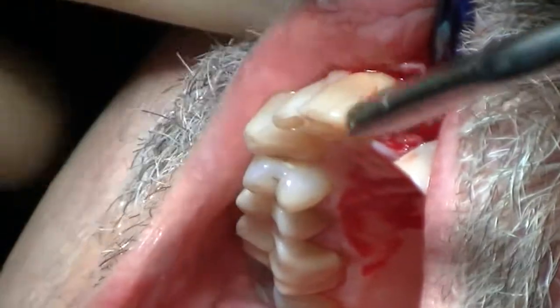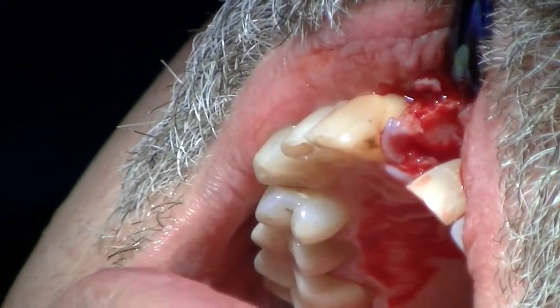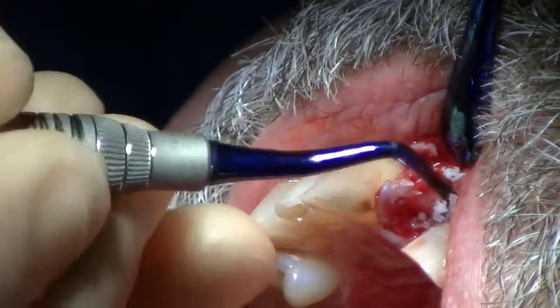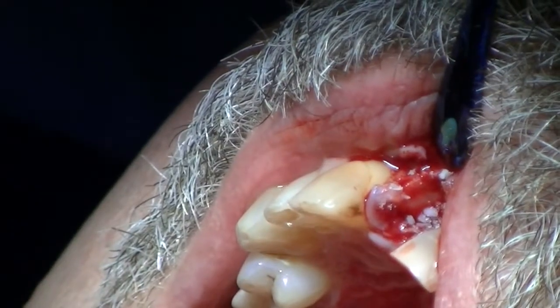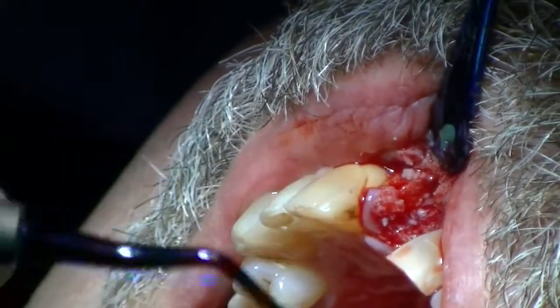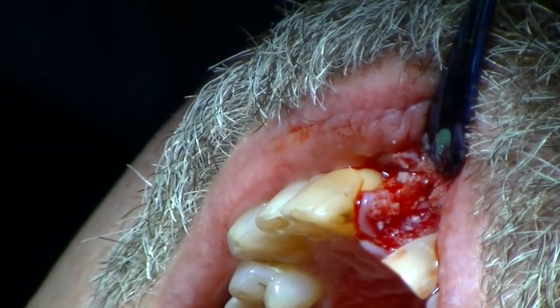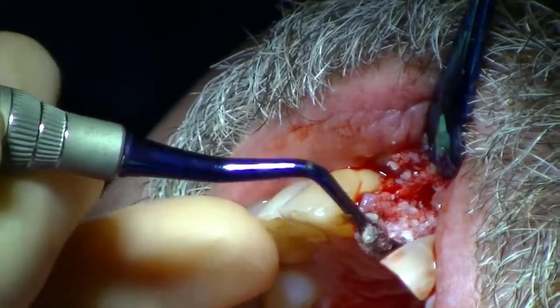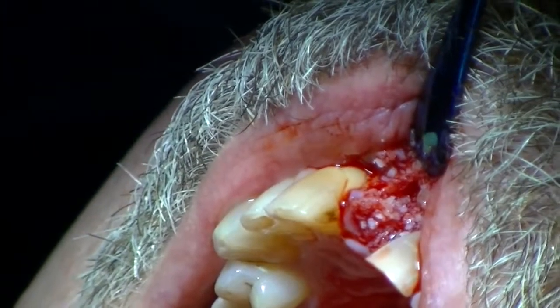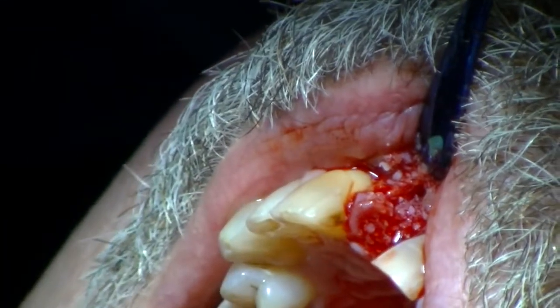So we have our defect here, and we're not going to suction now. I'm simply going to take my allograft material that I wetted, and I'm going to place it into the socket. If it touches the tongue, do not grab it off the tongue. It's just simply like caulking. Just enough. Can you suction that little piece off the tongue? I'm not packing it firmly, it's just loosely packed there.